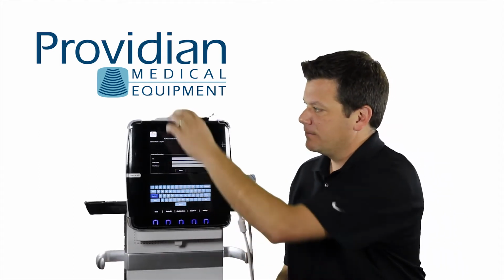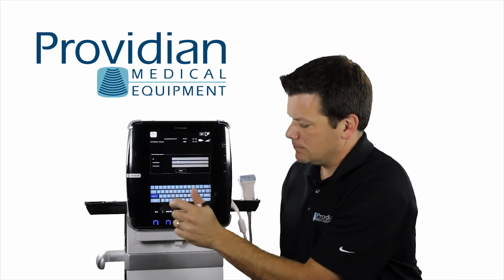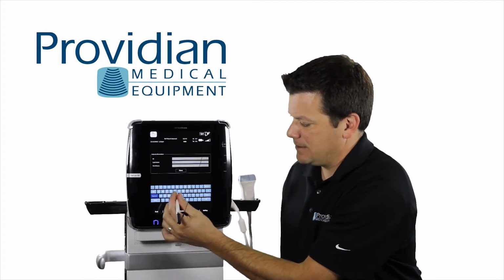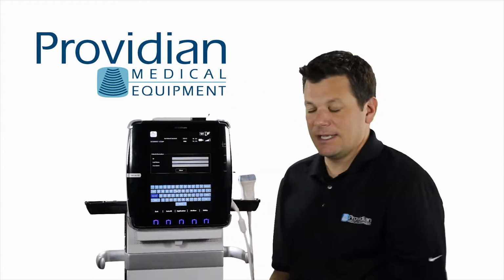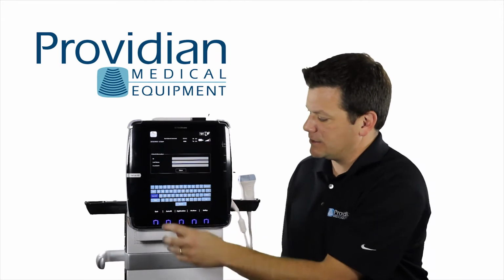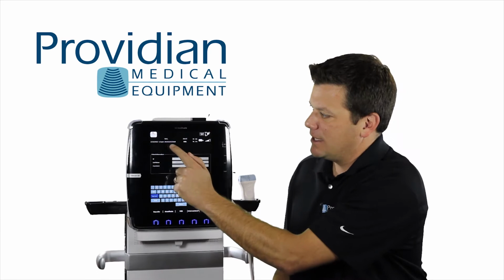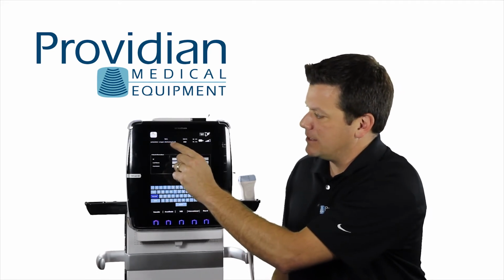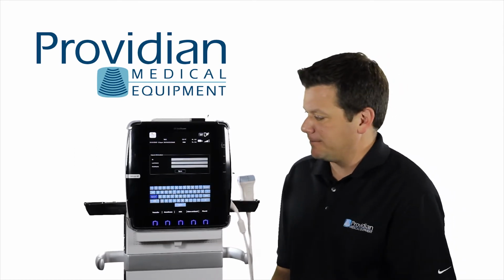But right now, I'm just going to plug in a test name. T-E-S-T. And then I can select Auto ID. If you don't use patient identification throughout there, you can select Auto ID. It will fill it in automatically. So now we have test and our patient ID here that shows the year, the date, the time that that patient began, and it will be a unique ID every time.